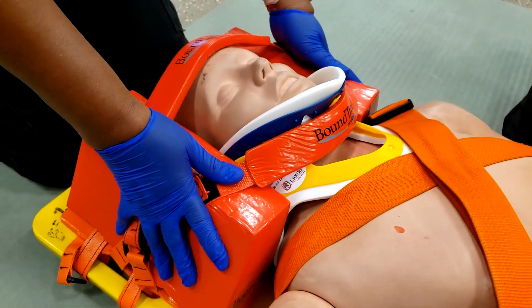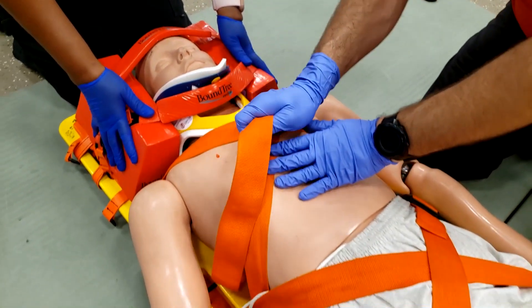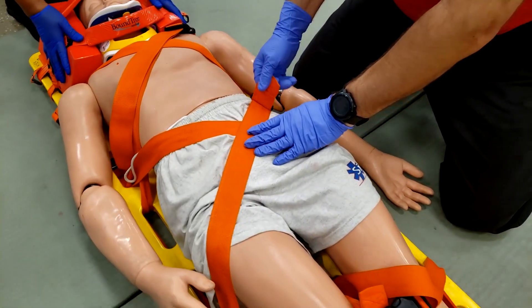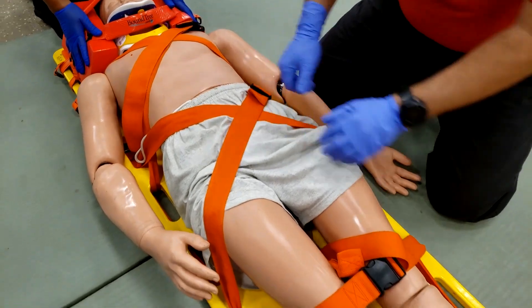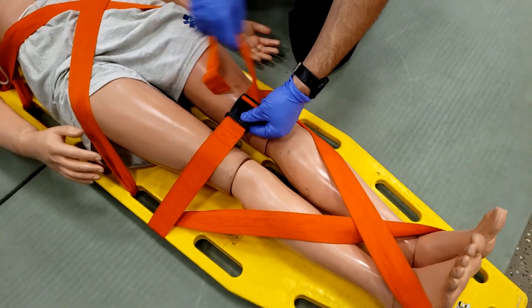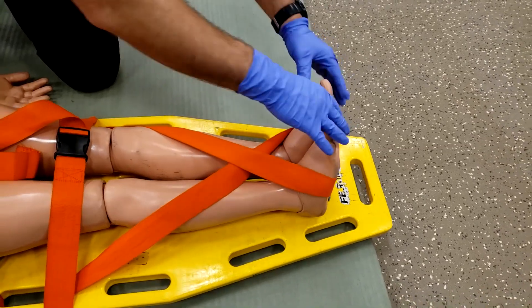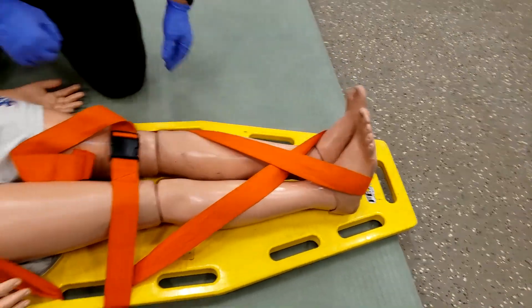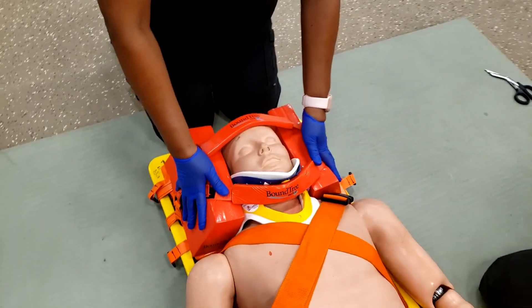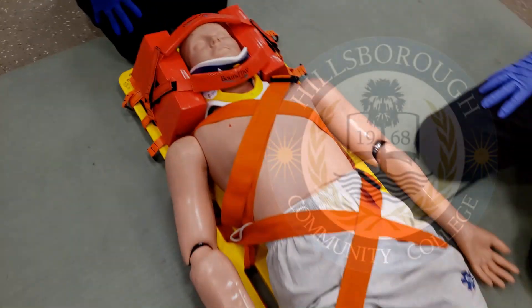Last, verify that all straps are snugged and secured. Check distal pulse, motor, and sensation before letting go of manual c-spine control.